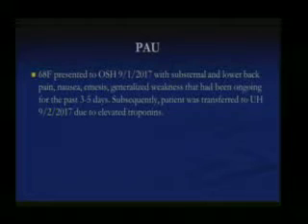The reason we elected to proceed with the stent graft in this patient was the penetrating aortic ulcer itself. It had almost an intramural hematoma kind of picture, and one of the penetrating aortic ulcers was extremely large, very worrisome for rupture.